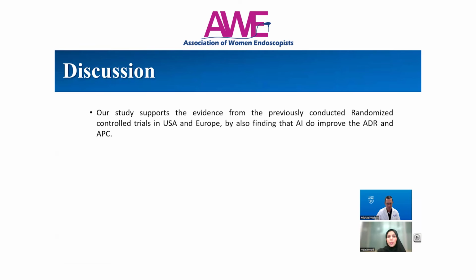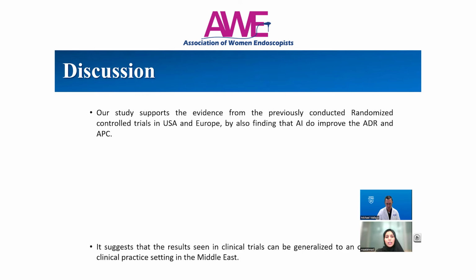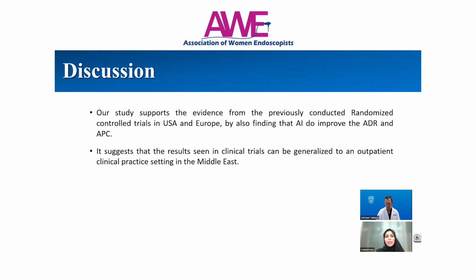So our study supports the evidence from the previously conducted randomized controlled trials in USA and Europe by also finding that AI does improve the ADR and APC. It suggests that the results seen in clinical trials can be generalized to an outpatient clinical practice setting in the Middle East.